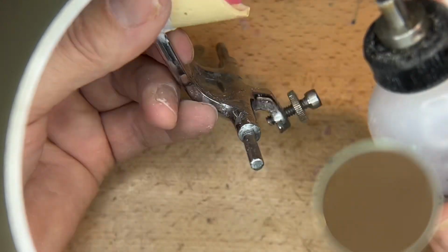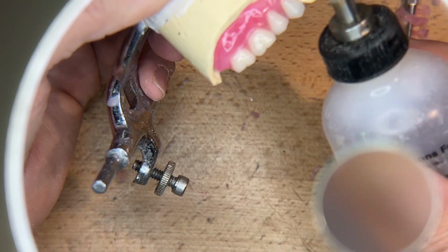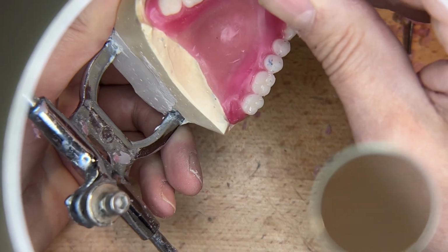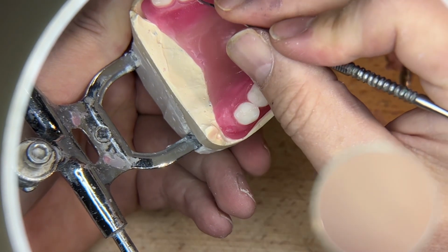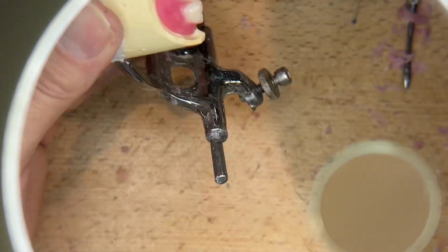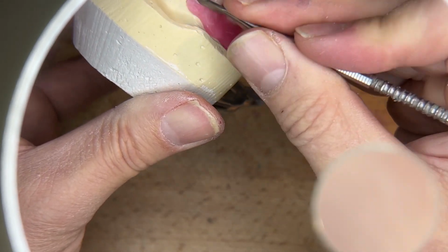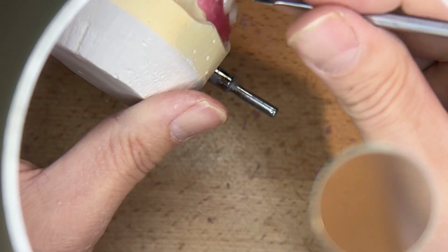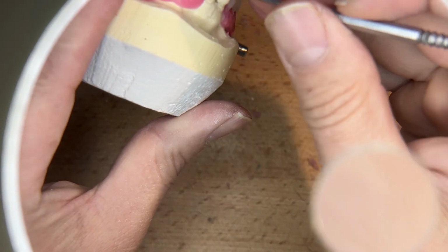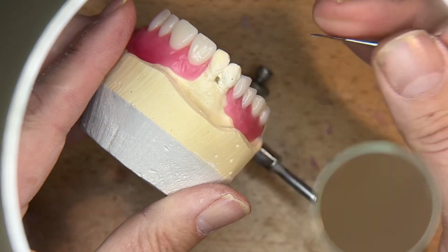Naturally, before try-in, we'll go back and double check if we've missed something. Just like anything, it could always be better. I could start spending more time, but like I said, I'll reserve some of the fine wax-up around the lingual gingival margins for the wax-up for finish. Since this is going to go for try-in, we may make some changes. This transition here is important, but we're going to have to add these two teeth anyways.